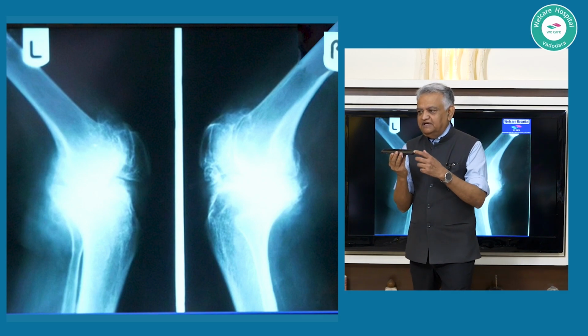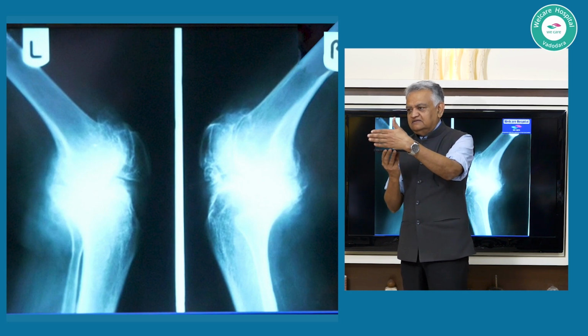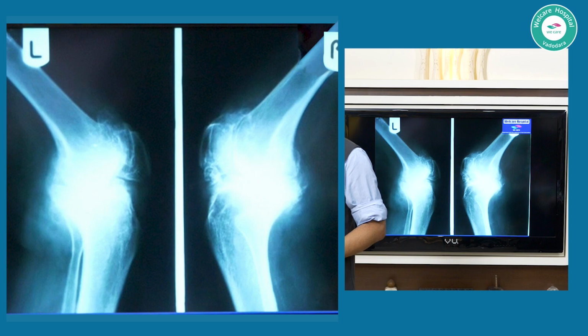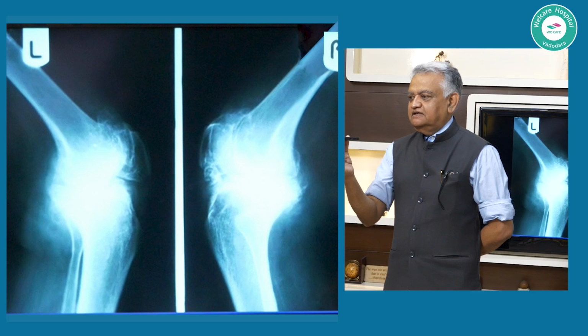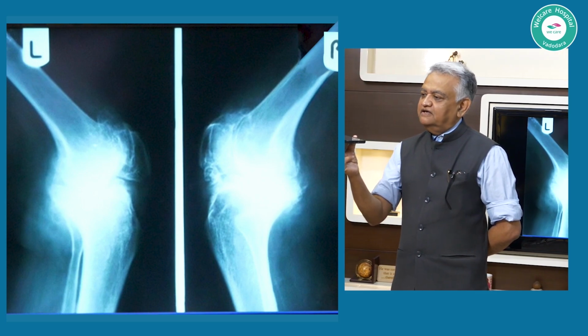Bring a small spirit level, put it on top of this, ask your colleague to say from a bit afar, and then when your spirit level is indicating the bubble dot in the center, and if he can say, yeah, now you are parallel, and when you do this and he can say, no, you are not parallel, raise it up a bit, and check yourselves out.